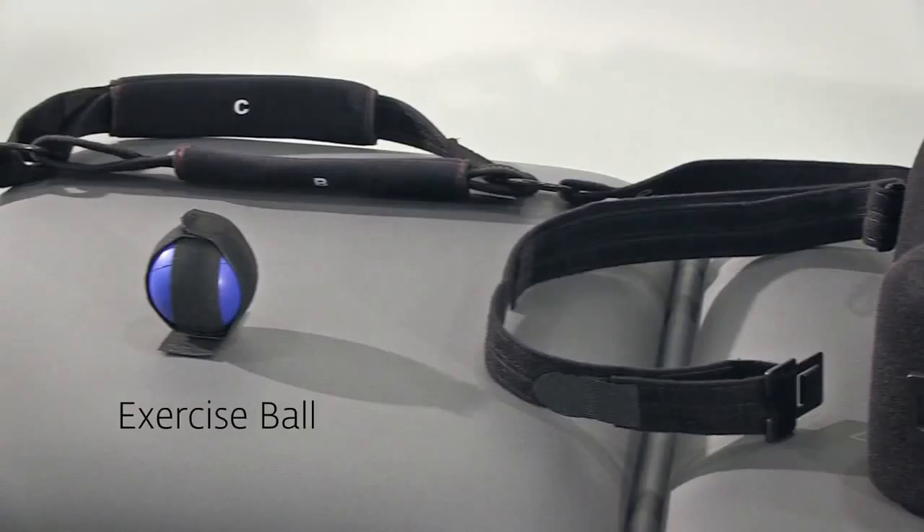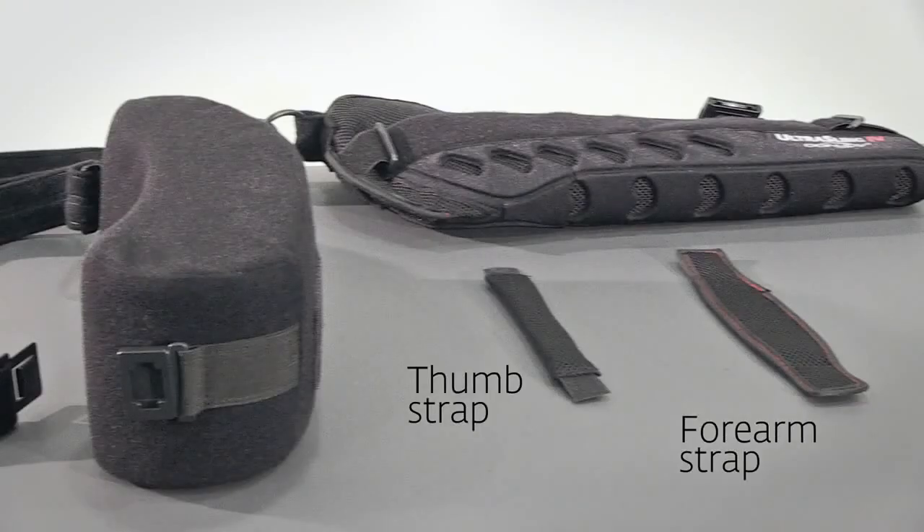The exercise ball can be attached to the front of the sling. Finally, there is a thumb strap and a forearm strap that can be secured once the Ultra Sling is on.